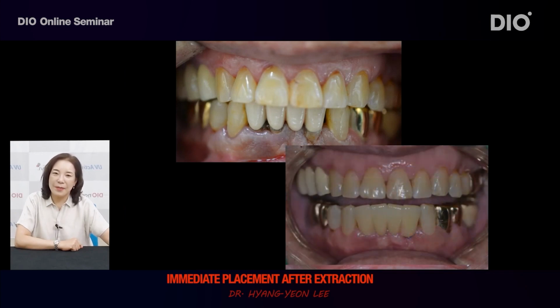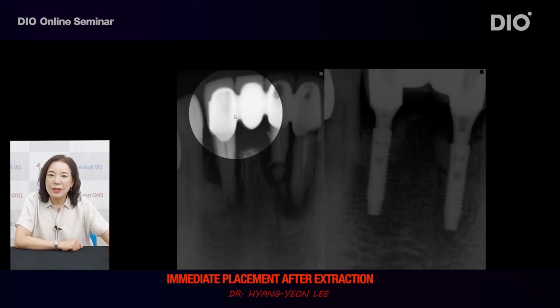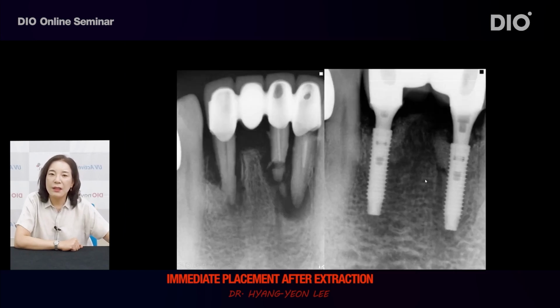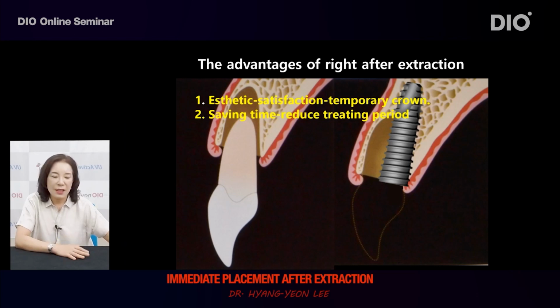This is a photo after completion of the procedure. Here is a photo where, in spite of the severe inflammation, the implant was placed with GBR after tooth extraction. Second is that the overall time decreased because implant was placed immediately after extraction without any healing time. That is, we can get more treatment time for other patients.